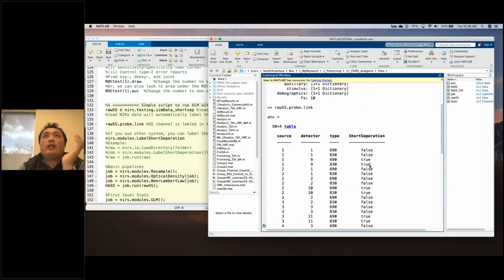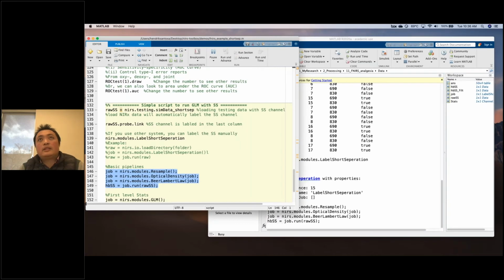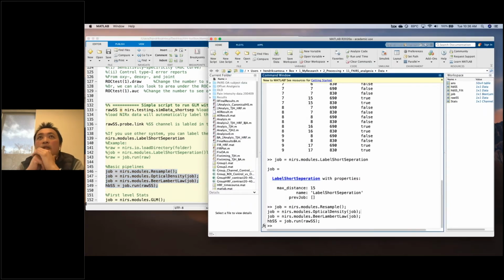So you will have the short separation label in the last column, and after that we can run the basic pipeline. First you need to resample. It's up to you, but we usually resample. The default is, I think, 4 Hertz.